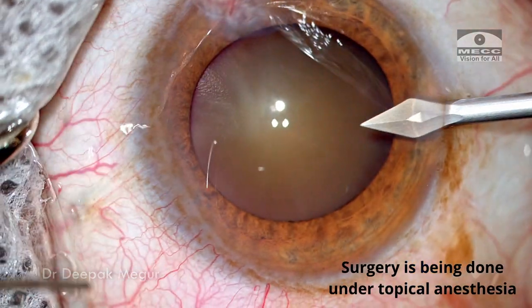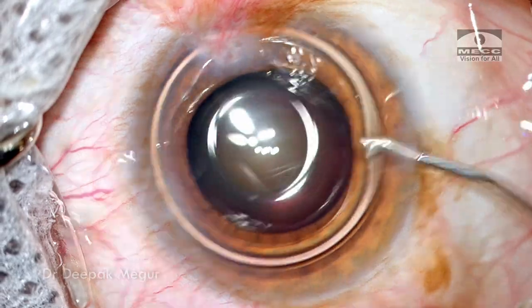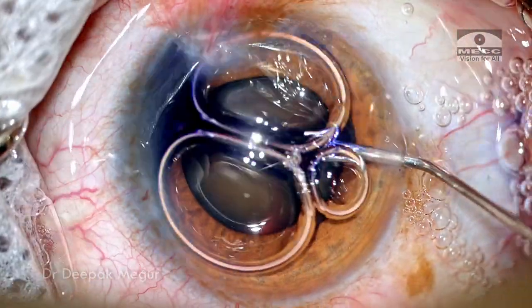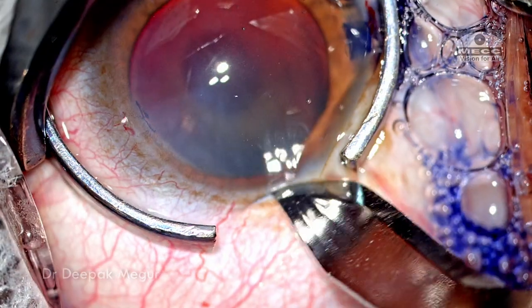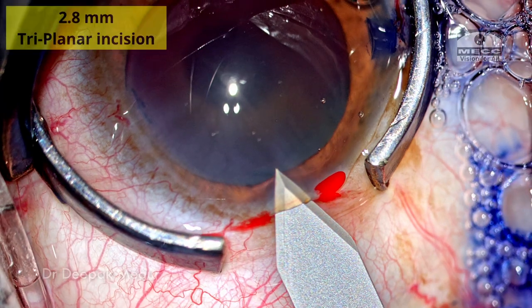The surgery is being done under topical anesthesia. The two side ports are made. Intracameral lignocaine is introduced into the eye, followed by trypan blue to stain the anterior capsule. Dispersive OVD is placed into the eye to pressurize the anterior chamber, and the 2.8 millimeter triplanar incision is created.